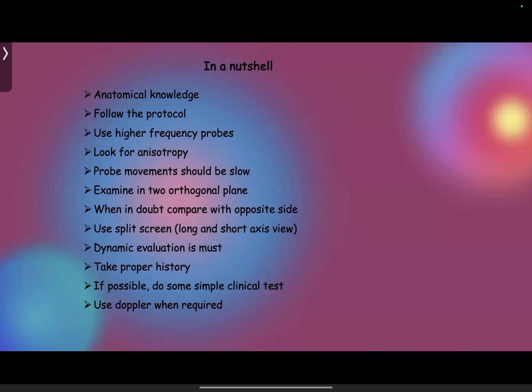So if the patient is having radial-sided wrist pain, and you are suspecting de Quervain's tenosynovitis, just do a Finkelstein test. That will build up your confidence in musculoskeletal ultrasound in your initial phase. Use Doppler whenever required, because as I have shown you, the synovium dips down around the bones. In pathologies like synovitis, synovial hypertrophy, loose bodies, and tendinosis, you will require Doppler. So use the Doppler.